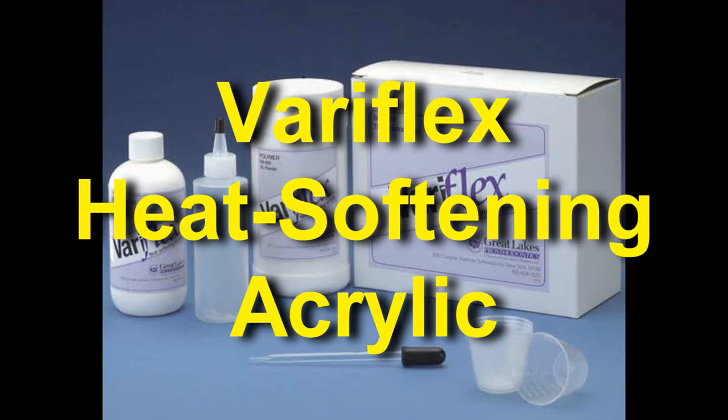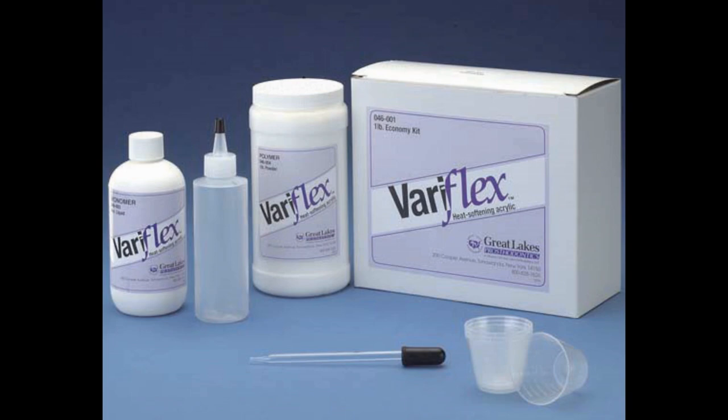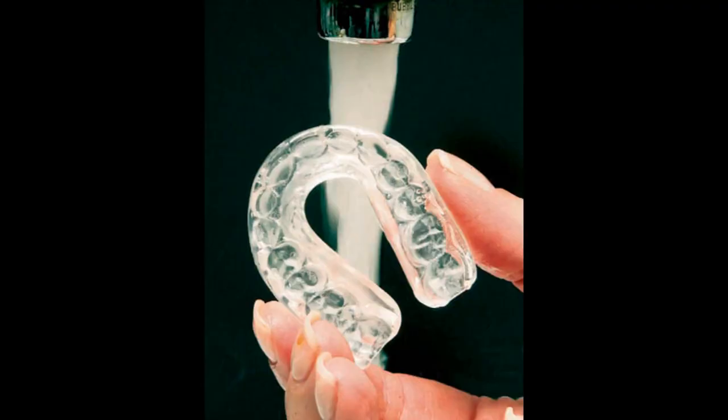Veriflex is a heat softening acrylic available at Great Lakes Orthodontics. It is often recommended for individuals possessing moderate dental undercuts where standard acrylic would be too retentive. When warmed with tap water, this hard acrylic softens, allowing it to have greater flexibility, providing a snap fit with easy appliance removal.